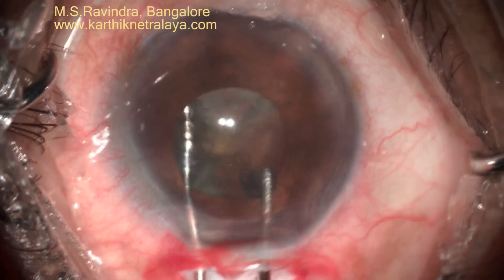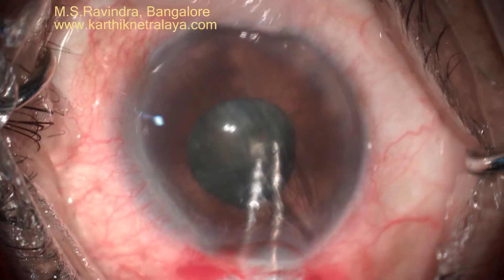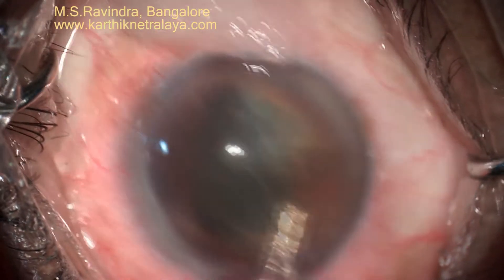Hydrodesection is performed using a special cannula. Hydrodesection separating the capsule and the cortex is of paramount importance in these difficult cases so that cortical aspiration becomes easier.